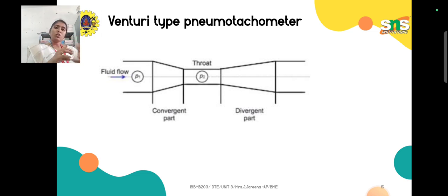Based on the geometrical design and construction difference, we offer a pressure difference. At the starting and ending stages you have the same width of the tube, and slowly it converges, and then slowly it diverges.